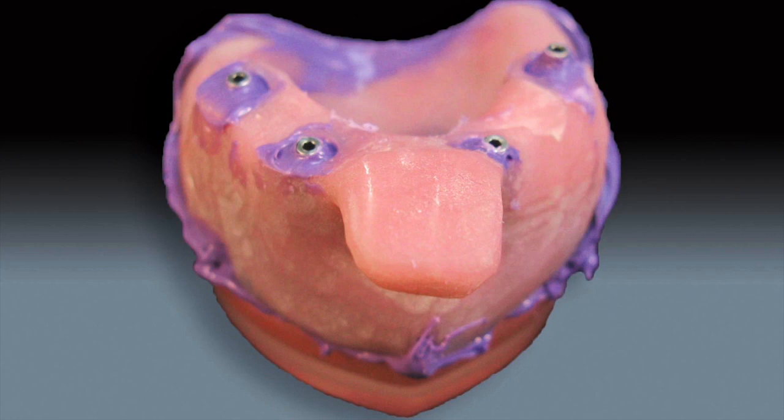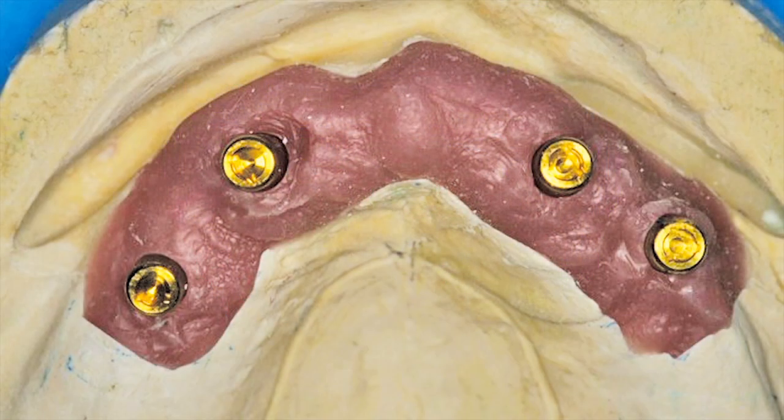Let the impression material cure completely, then loosen the guide pins and lift the impression copings out inside the final impression. Since there's no reseating of the impression copings back into the material, you're pretty much guaranteed a nice accurate result. Then place the healing caps or healing abutments back onto the implants. At the next appointment, once we've poured up the master impression, placed the analogs, and positioned the locators, we'll send you a bite block.